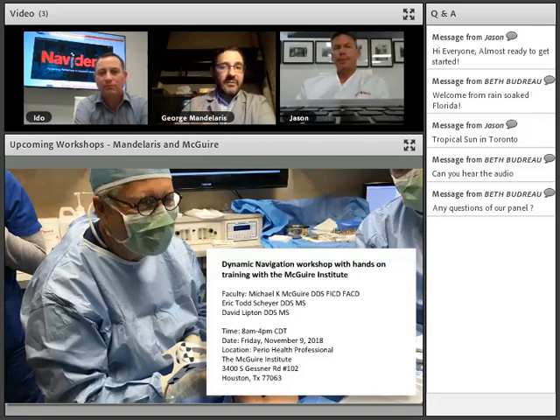So we have to be a little mindful of that, and that's where I think Luigi's study was really very valuable, because he showed as long as you use the technology and the accuracy inherent within it, and you place the implant, even manually, you're going to get a very, very accurate result, if not more accurate than using stereolithography. Yeah, that point, as you mentioned, 0.12, 0.13, it seemed to be the average difference when he guided the implant and when he didn't.